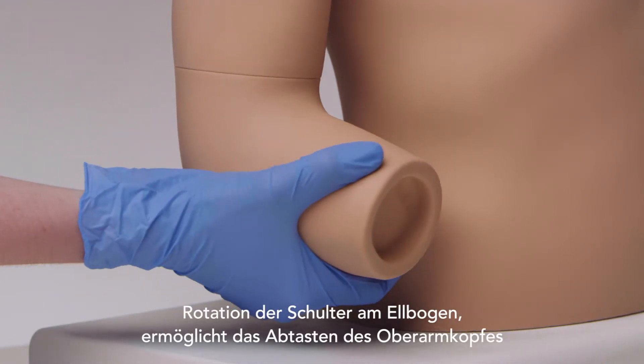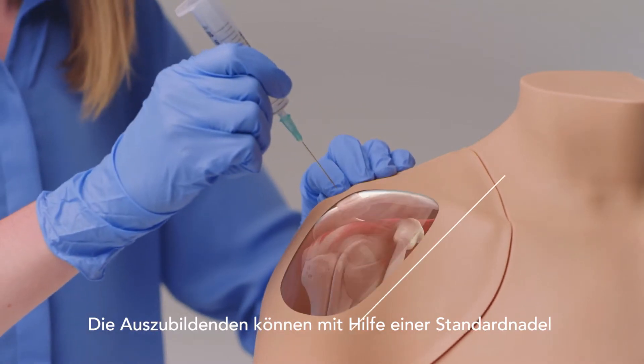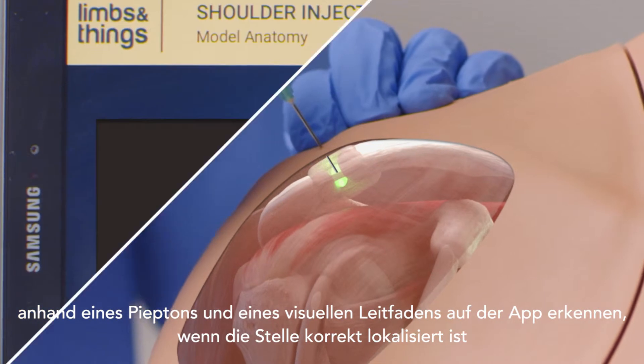Rotation of the shoulder at the elbow allows trainees to palpate for the head of the humerus. Using a standard needle, the trainee can identify when the site is correctly located with the help of a beep and a visual guide on the app.